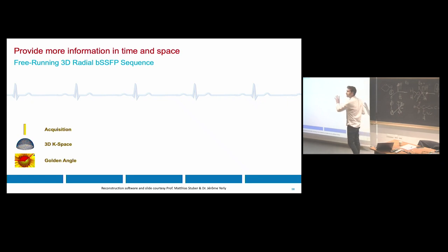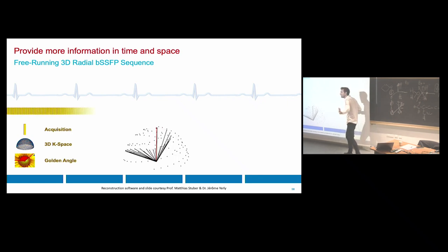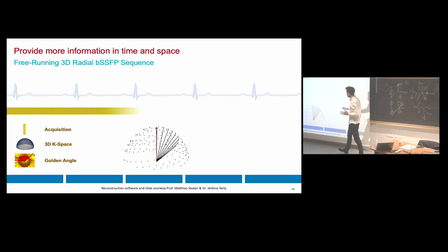There have been solutions coming out, and the team of Matthias is doing a lot of revolution in this field. Let's forget about the ECG. Let's forget about the breath holding. Let's forget about the electrodes. Let's collect images continuously with a very smart sampling.